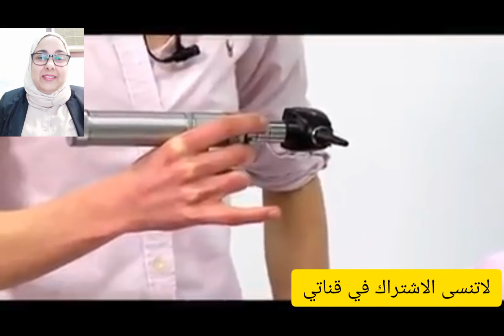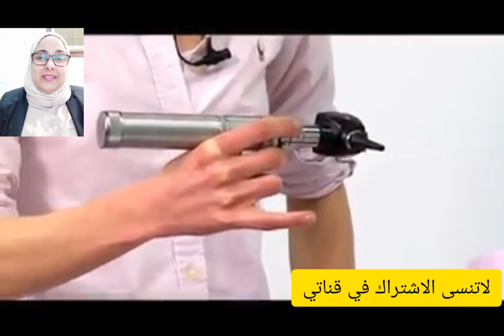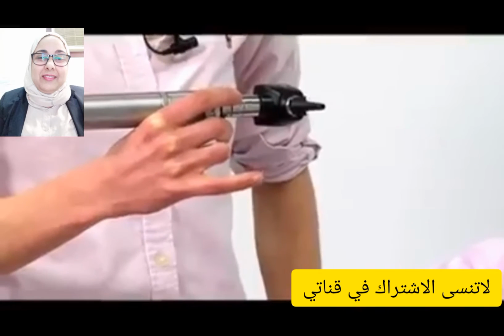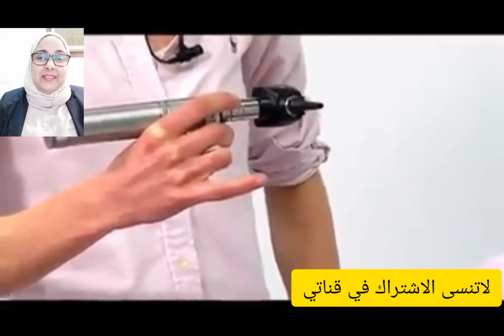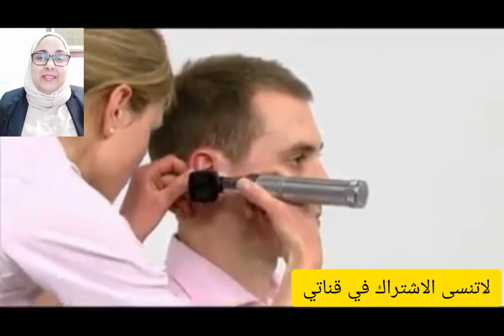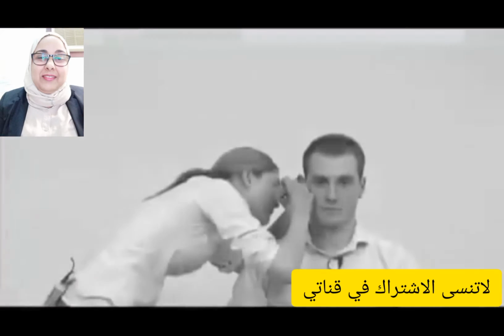When examining the right ear, hold the otoscope in your right hand. Hold it like a pen balanced between your thumb and index finger. Extend your little finger and use this to rest against the patient's face. This means that if the patient moves his head, your hand and the otoscope will move with it, and the otoscope will not stab into the ear canal and cause pain. This is of particular importance when examining children.